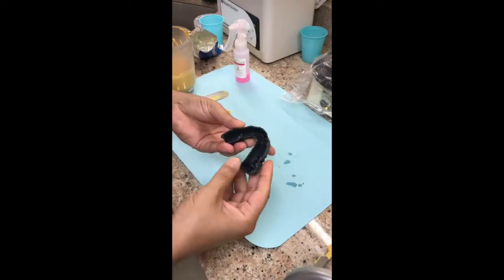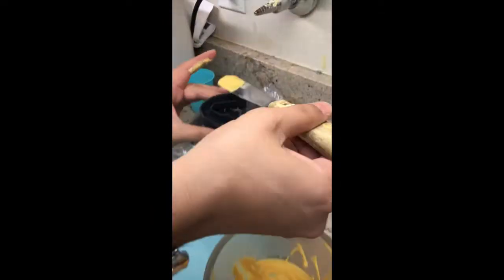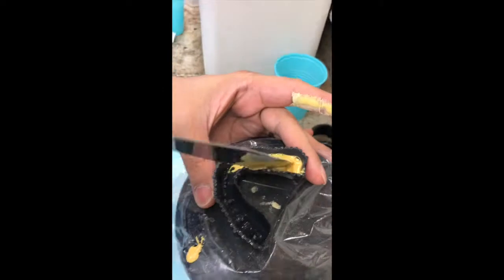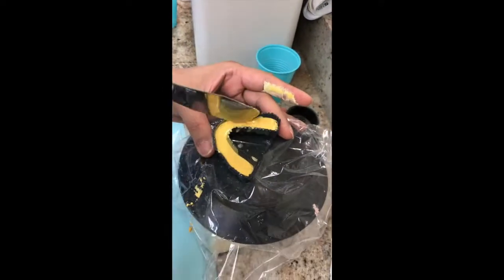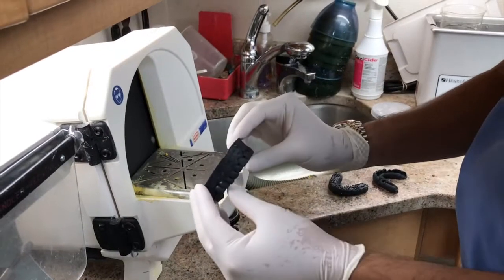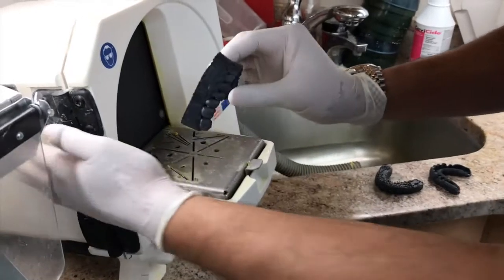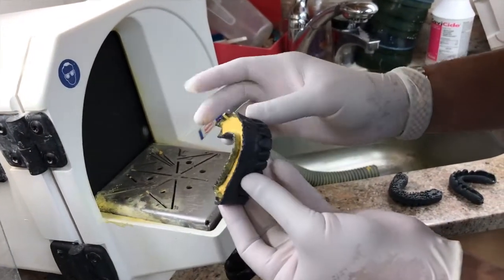The model is flexible, so I poured some stone to add structural rigidity, leaving the surface flexible. A model trimmer was used to remove the residual supports.